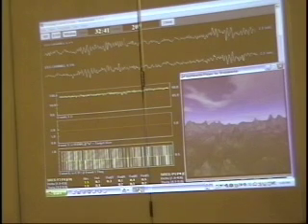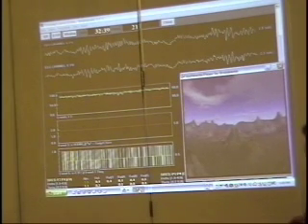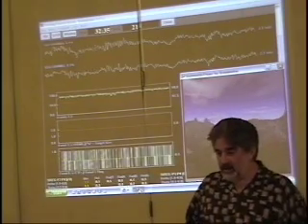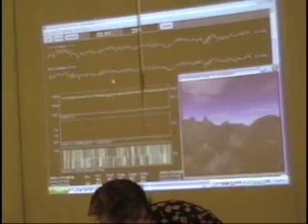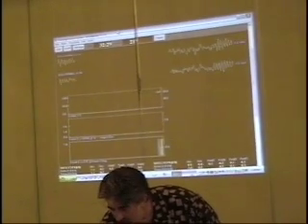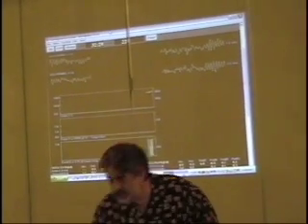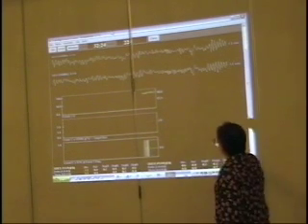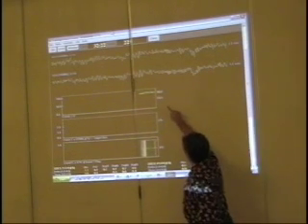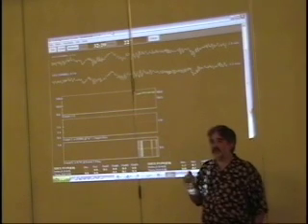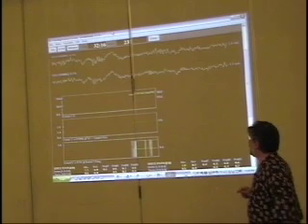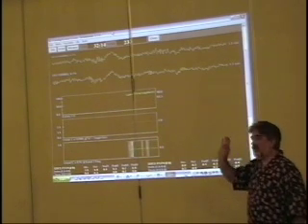Tom, it seems to have leveled off about 50. Why wouldn't you increase the target size? I would — so let's raise the target size. Now it's two standard deviations, with a target size of two standard deviations. We've made a significant change. We're getting lots of feedback now, so we found the corner.